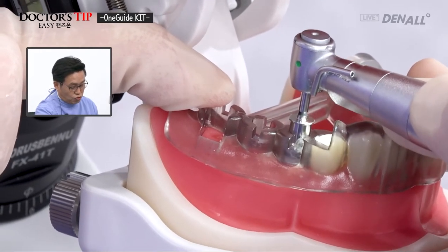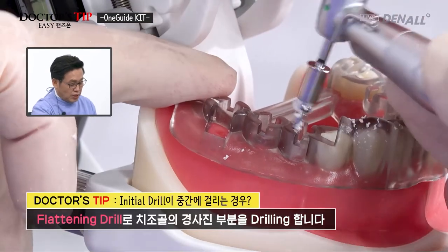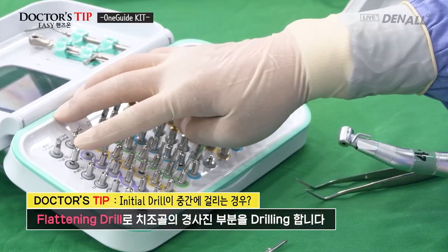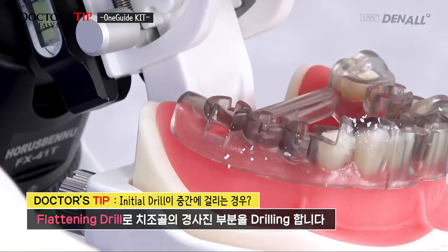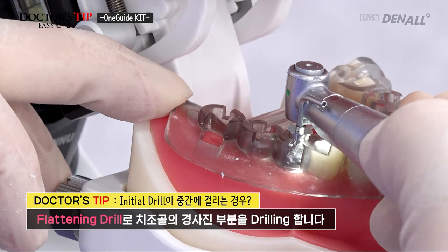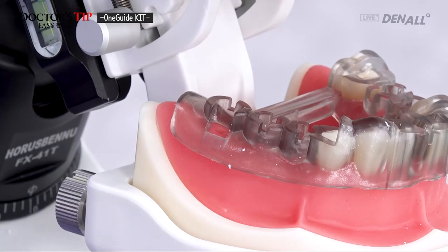If it does not go in full length and if there is some sort of jamming, as I mentioned, you need to use the flattening drill. As you can see, it goes full length, but if you feel like it's not going fully in, you need to use the flattening drill. And if there is inclination in the remaining alveola, you need to use the flattening drill full length. After that, the initial drill will go in sufficiently.